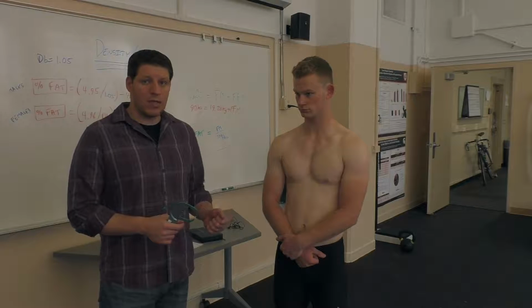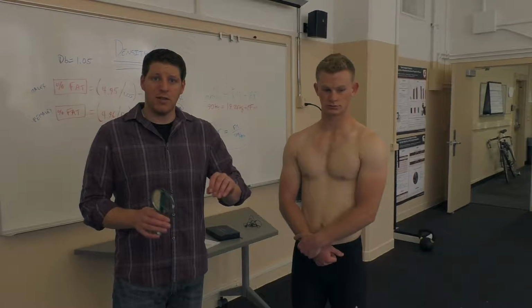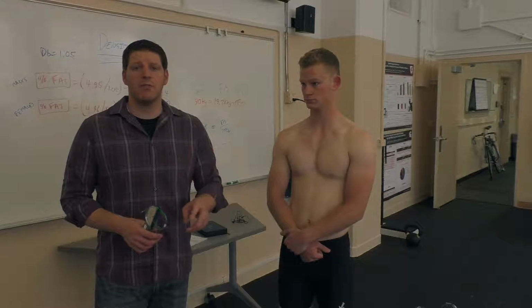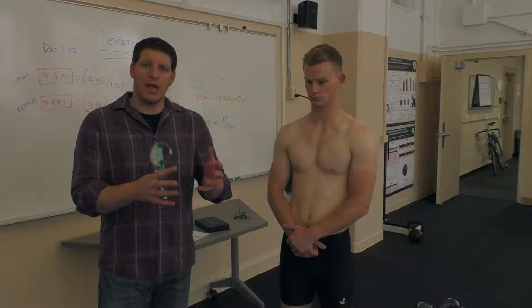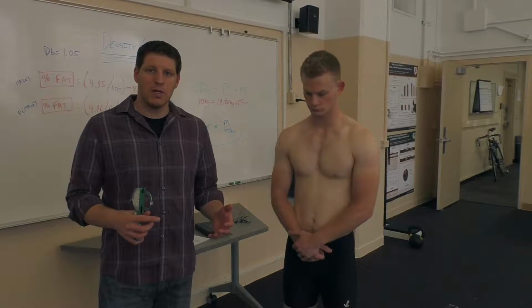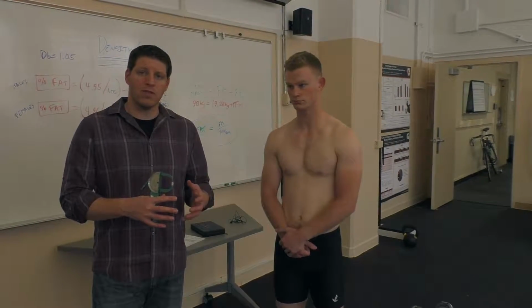So what we will be doing is using 7 sites, and as you guys probably know, skin folds is where we will be pinching certain parts of subcutaneous fat at different locations throughout the body. And so we will take measurements at each of these locations, and we will sum those measurements. Specifically, we're going to do 2 rounds of measurements, and we always do 2 to make sure, essentially, that the first and the second reading at each skin fold site are close enough in agreement. And if they're not, then we need to do a 3rd, okay? But once we have that sum of skin folds, we can plug that into the equations at the bottom of your data sheet, where you'll probably notice if you go look at your data sheet, that will give us density.